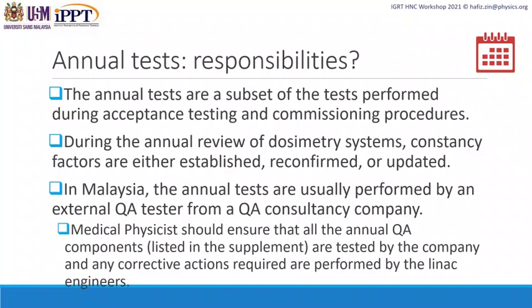But they should be highly involved during the test to ensure that all the annual QA components listed in the supplement are tested by the company, and any corrective actions required are performed by the linac engineers. So you cannot leave it to the external tester. You need to monitor what they do and also make sure that it is within the tolerance value that you expect. And if there is any discrepancy, it needs to be referred to the service engineer, the manufacturer, for corrective actions.